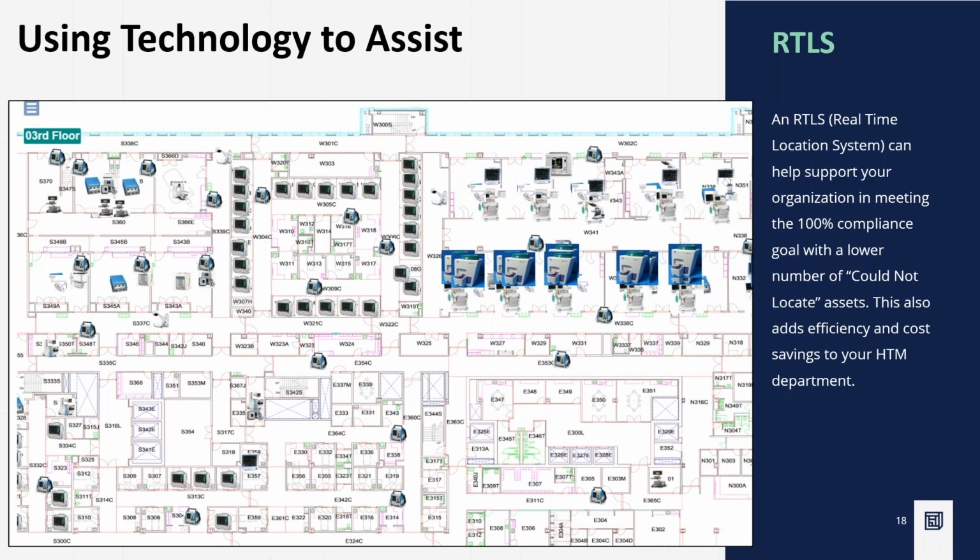It is based on how good your RFID system is, and your networking infrastructure is a big component of that. There are still hospitals that have no Wi-Fi in certain areas. The basement is like the dead area. You can't use it in those areas. So if somebody is hiding a piece of equipment somewhere... We have one customer where all the Wi-Fi just shuts off, so all the equipment is located at the door to the shop. If it goes into the shop, there's a big group of equipment right at that door, and if it goes out the back door and in somewhere else or to another hospital, it's like a big clump of equipment right there. But an RTLS system, a real-time location system, is one way to help you find those things.